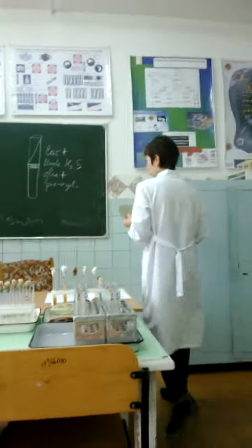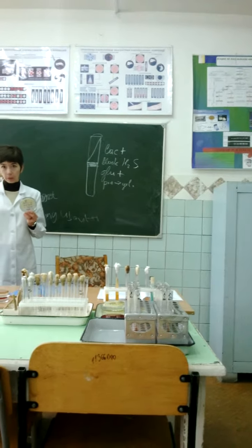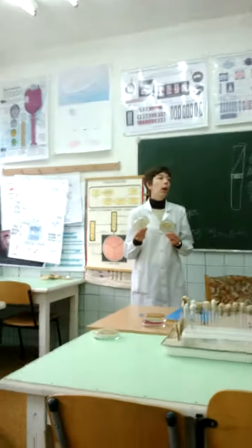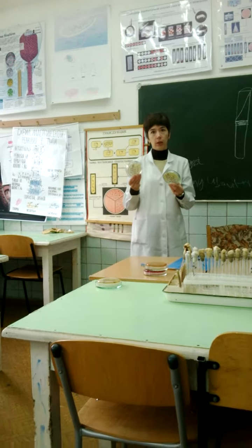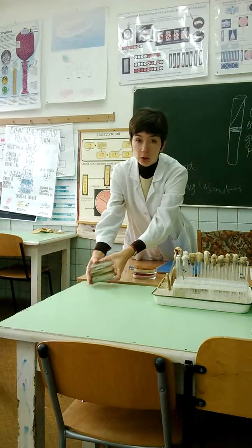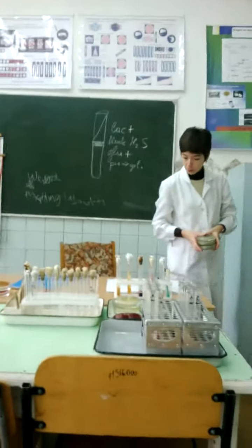Then you should decide what the test is, phagosensitivity or phagotyping. You should say why we use this test: it's to find the source of infection. You should describe how to set up this test and how to read results. It's especially used for nosocomial and hospital infections such as staphylococcal infections.